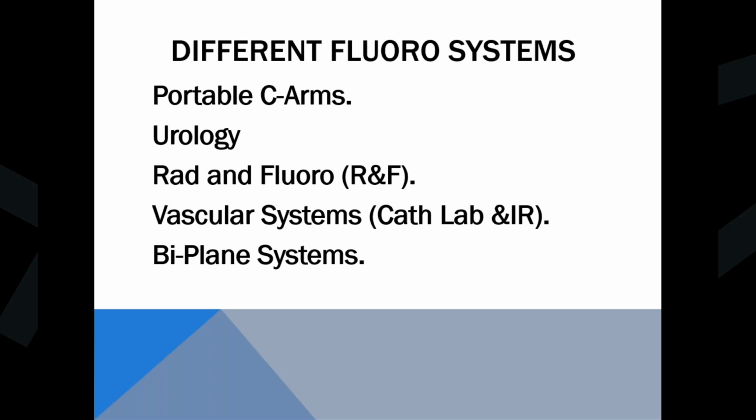Another area that you'll run into fluoroscopy is urology, and that's kind of a more specific application of it. As a matter of fact, a lot of places probably don't even have a specific urology room anymore, but you might still run across those.